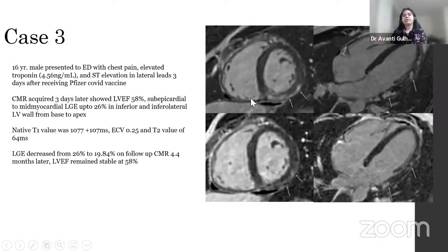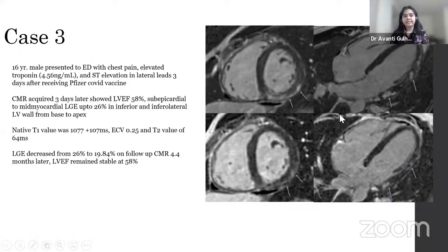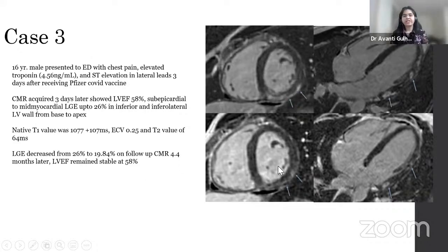A more severe post-vaccine myocarditis case: a 16-year-old male presented three days after receiving the Pfizer COVID vaccine with chest pain, elevated troponins, and ST elevation in lateral leads. Cardiac MR showed subepicardial to mid-myocardial LGE in the inferior and infralateral wall with 26% fibrosis. LV ejection fraction was preserved. Native T1 was mildly elevated; ECV was not significantly elevated; T2 was significantly elevated at 64 milliseconds. Four-month follow-up showed a decline in LGE on visual assessment, with stable LV ejection fraction.